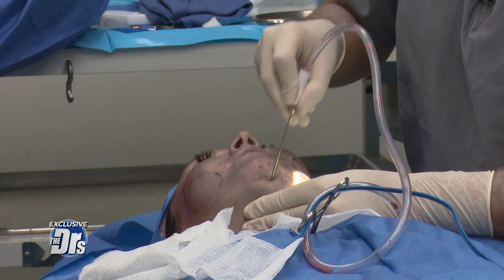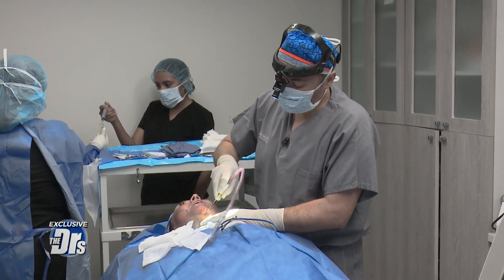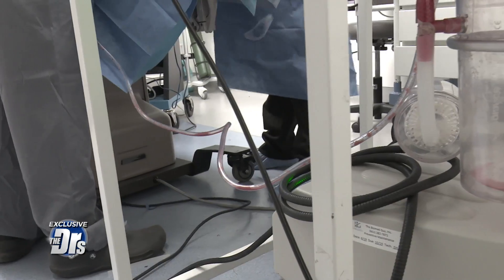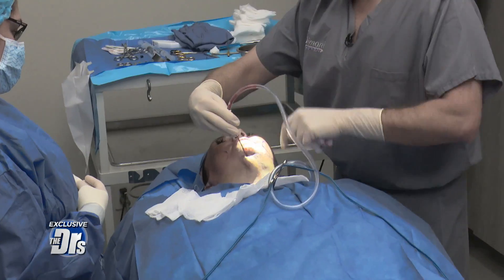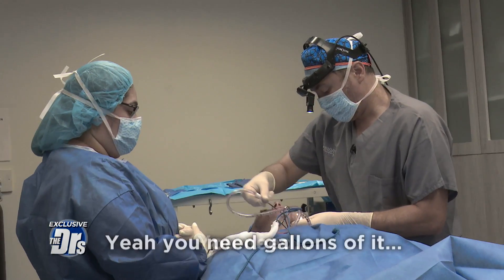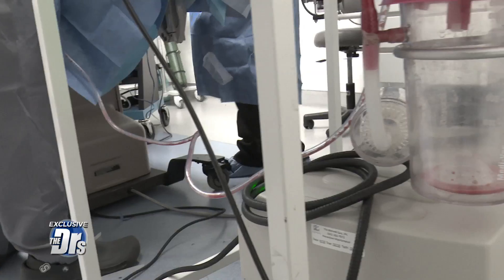The first part is to do liposuction of the neck, and you can see that the fat is, little by little, coming through that little tube. Is that fat? Yeah, that's the fat — your fat coming through. You need gallons of it coming through.